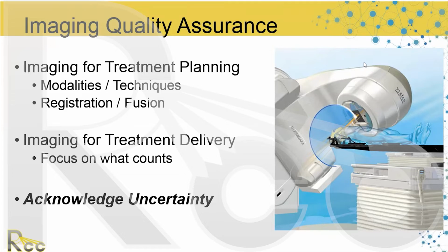We don't register with our eyes closed. Don't just use auto registration and assume it's correct. Even if it does do a good job, that doesn't mean that the previous registration was aligned properly. Being mindful of that is important. And then in treatment delivery, I think I may have mentioned this before: focus on what counts. If you're treating the breast, it's the surface, the actual contour, that's important. If you're treating the prostate, it's that soft tissue that's important.